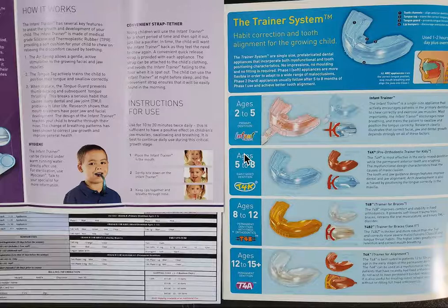So these are good. I've also done some cool modifications of these appliances where you can add, especially if a patient has a little bit of an underbite, you can customize it, cut it out so you can get some flaring of the front teeth. You can add some bite bumps to the back teeth to help to raise the bite and get some intrusion. So there's a lot of cool things that you can do with these, okay? So that is the trainer system for kids and young kids. So again, ages 2 to 8 is who I'd use it for.